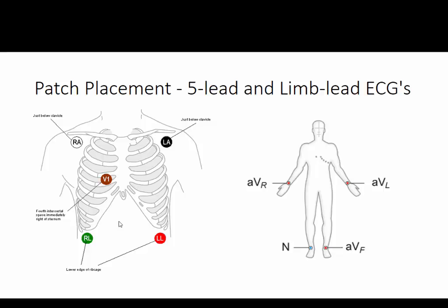And the person in charge of central monitoring, the worker, sometimes it's a nurse's aide with special training that's in charge of that central monitoring room. So it's not something that is highly skilled. You can be trained to identify these rhythms. And then they'll call the nurse's aide. If it's just a low battery, they'll say, hey, can you replace the battery? Or if something looks funny because a patch fell loose, the patient was sweating or bathing or moving around in bed or pulled one off, then they call and ask to replace it.